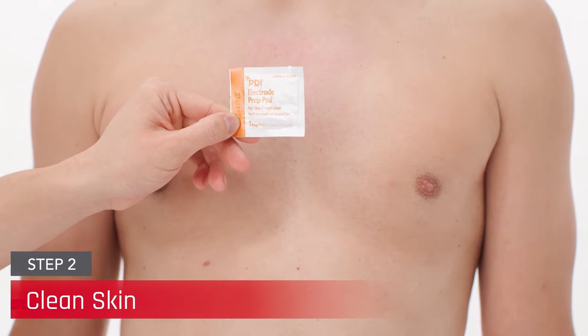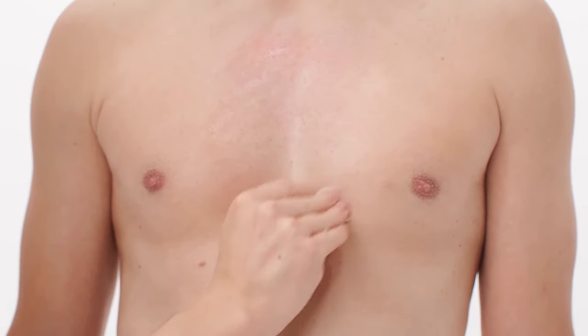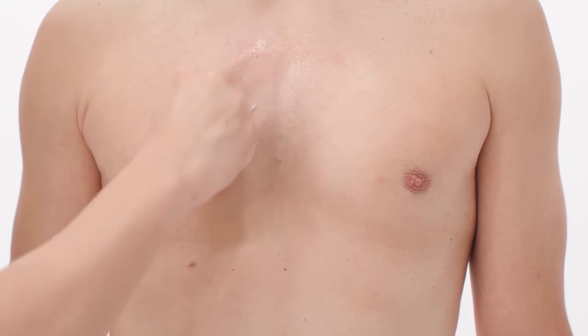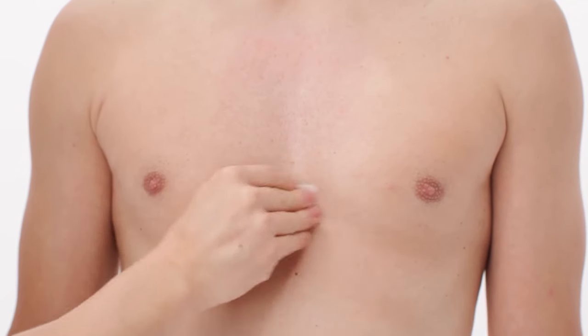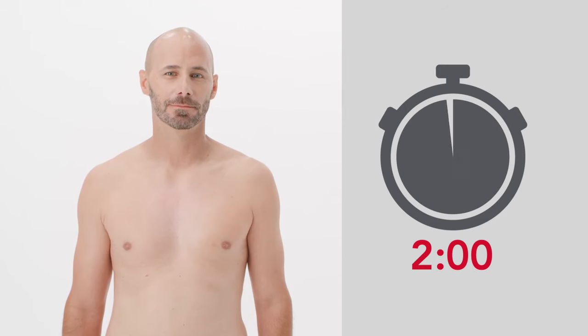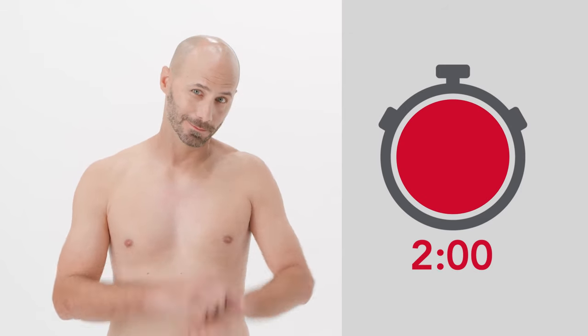Continue the skin preparation process by thoroughly removing dead skin cells. Using all 3 prep pads included in the box, scrub the skin well enough so it is slightly reddened, but not raw or painful. After cleaning, allow the area to dry thoroughly without touching it before applying the CAM patch, as skin oil on the fingertips may transfer to the application site and interfere with ECG quality.